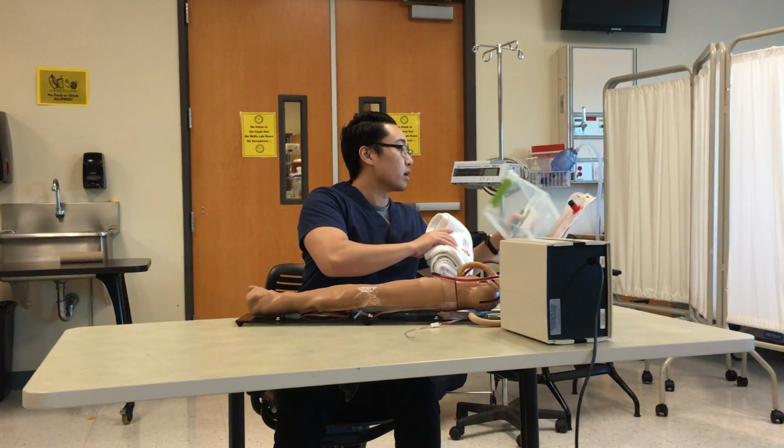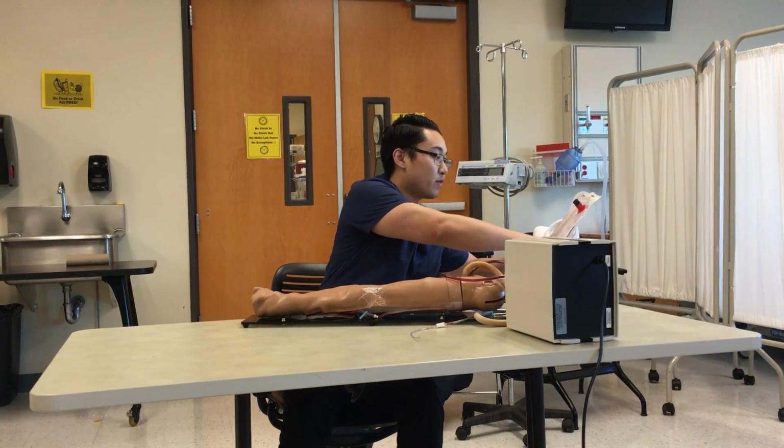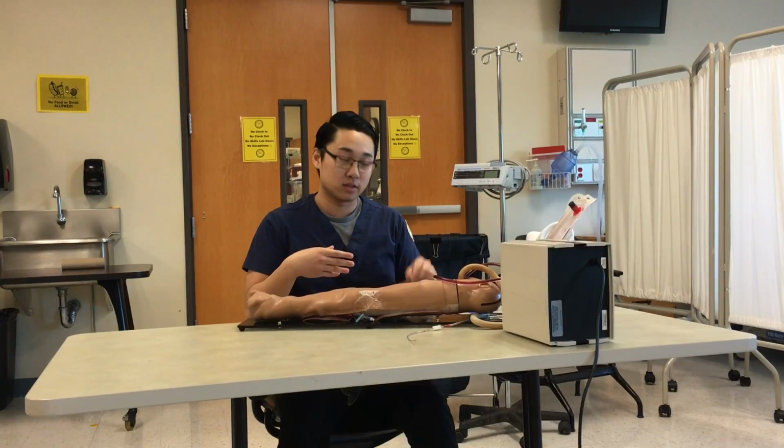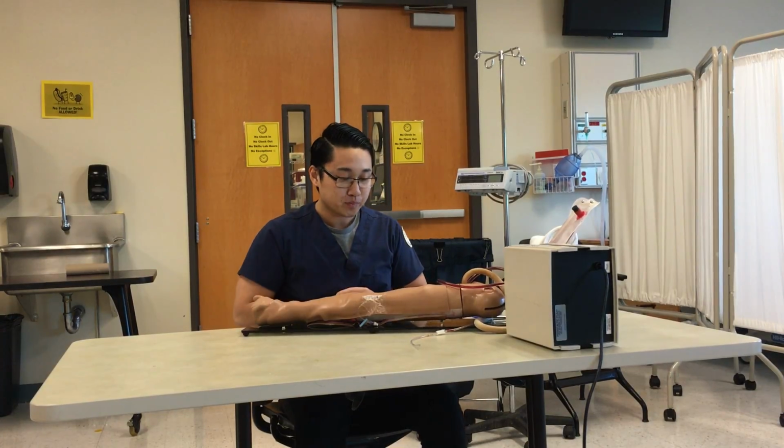And also I'll get a bucket or an ice slush for the ABG if I plan to take more than 15 minutes to run the ABG. And the limit for waiting on analyzing an ABG is 1 hour. After an hour, you're gonna have to resample the person.